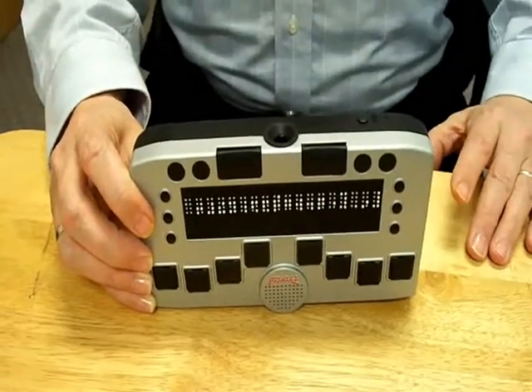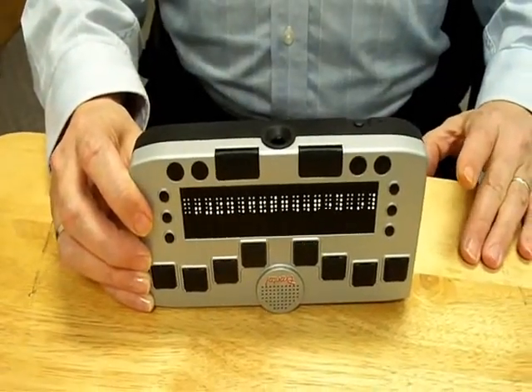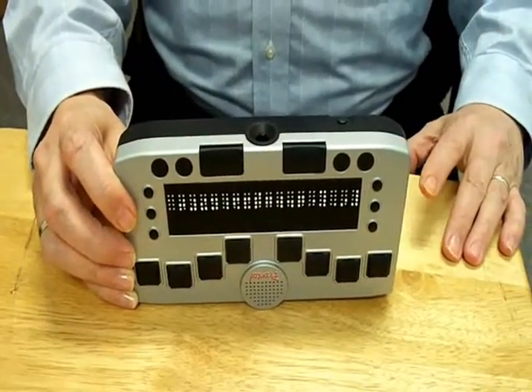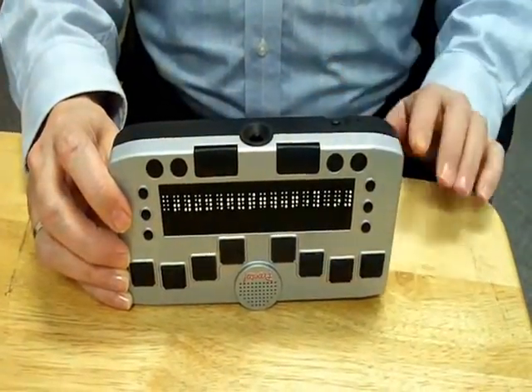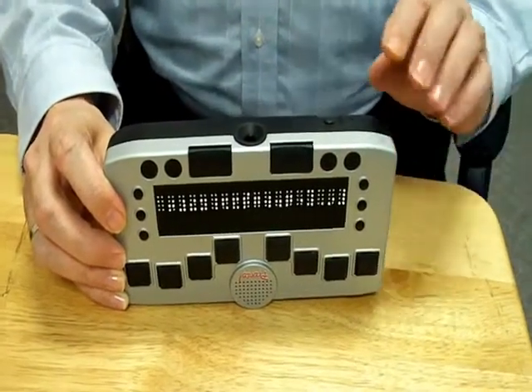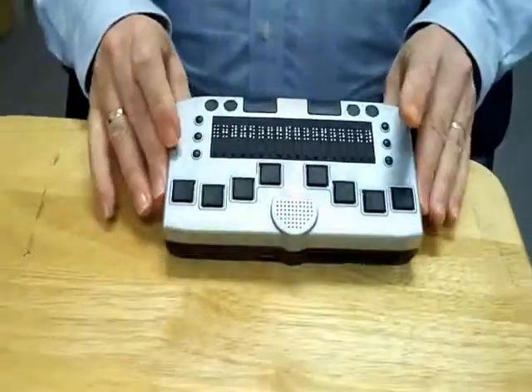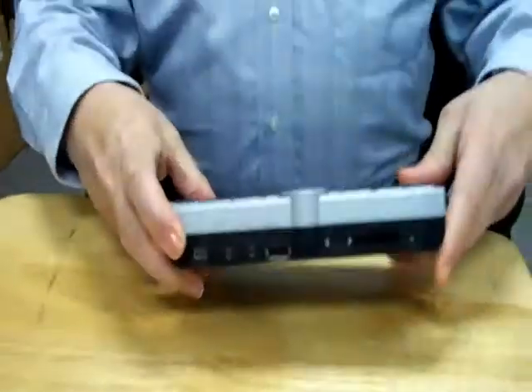You also can go into a menu and turn recording on and leave it recording, and then not have to hold this button down to make a recording. So there you have the front edge of Pronto. Now let's examine the back edge.